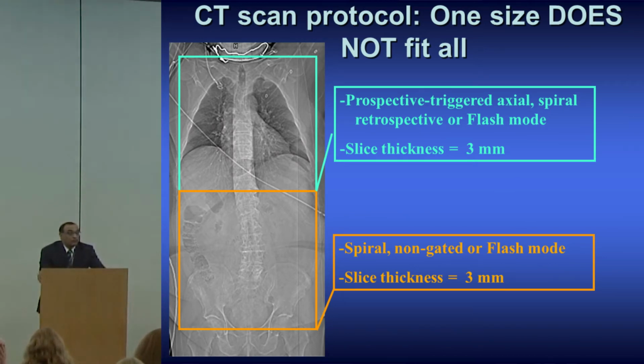Echocardiogram is very much dependent upon the sonographer measuring the images. If they are recording images that are not optimal, and sometimes Marfan folks have pectus, where the chest is indented, the images may or may not be optimal.